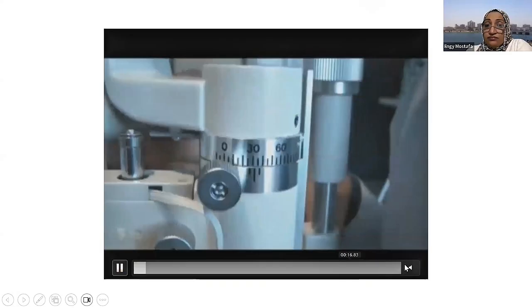So it is all about fine-tuning of your movement of the joystick. And instead of using it to just visualize the cornea, you can move it a little bit forward towards the patient to visualize the lens. And of course, when we visualize the lens, we can get to the LOCS classification, and we can classify it very easily according to whether it's nuclear or subcapsular or cortical as well.